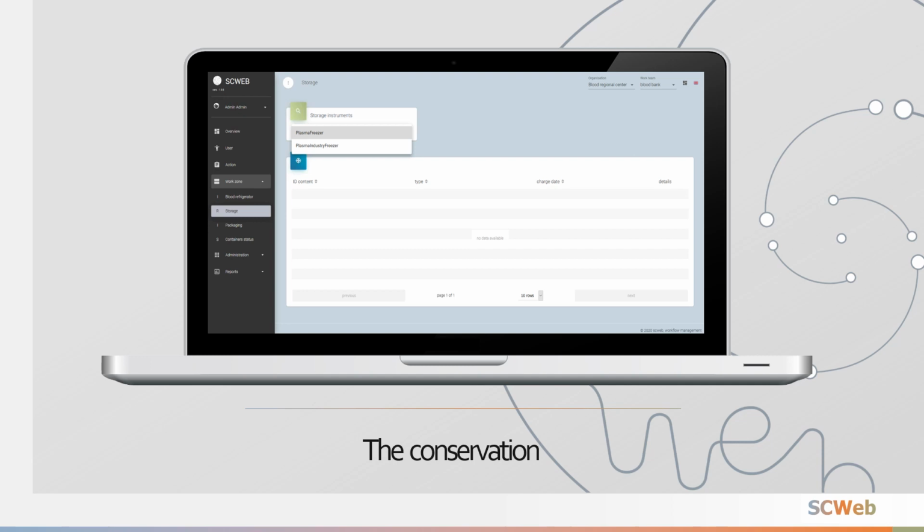With regards to the conservation, the system foresees the traceability of all the loading and unloading actions of the transport boxes, or single units for each individual freezer, blood bank refrigerator, and platelet storage system. It will be possible to see the contents of every single tool and consider the duration and transfers of each unit.